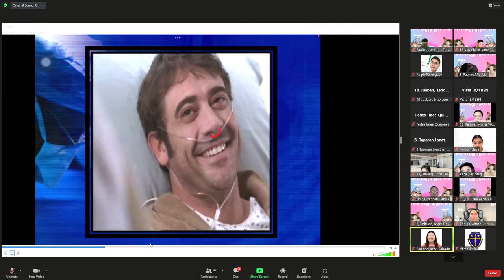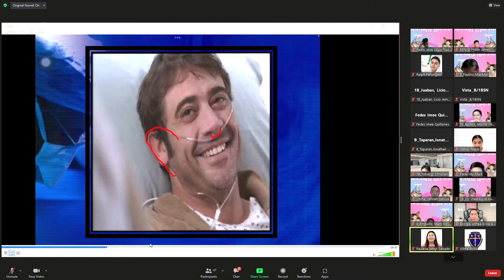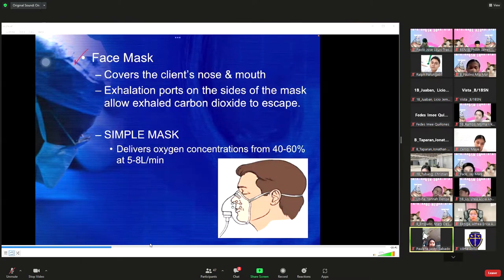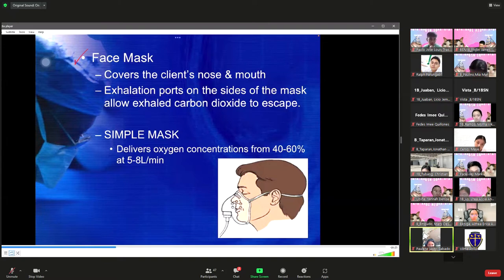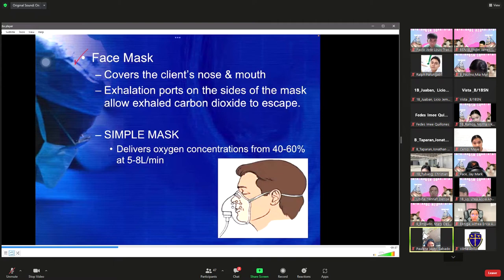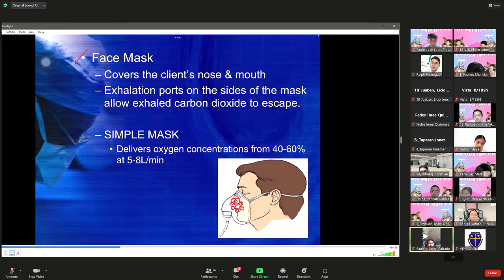To apply the nasal cannula, place the nasal prongs into the patient's two nostrils, then coil or loop the tubing behind and over the ears — do not just place it behind; it should be secured around the ears for patient comfort. The face mask is another type of oxygen delivery system that covers both the patient's nose and mouth. Exhalation ports on the sides allow exhaled carbon dioxide to escape.